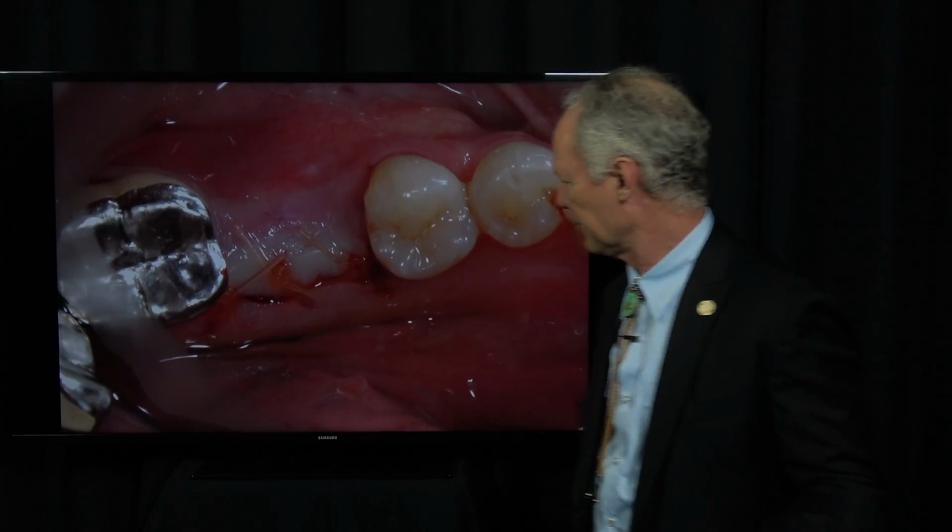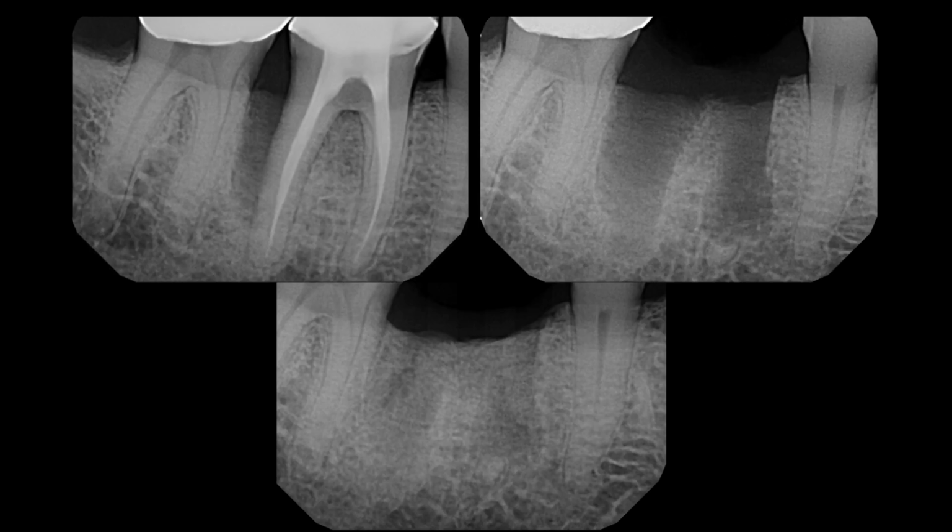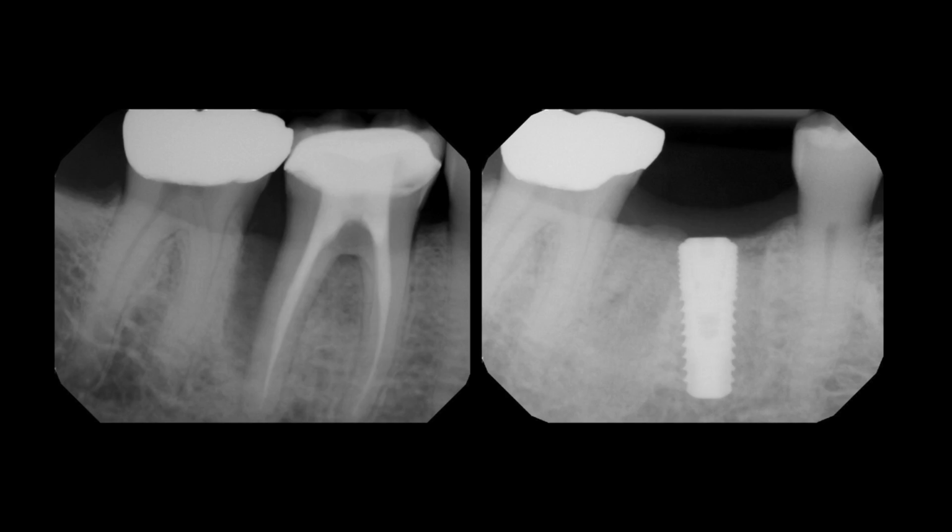All right, so extraction of a mandibular molar tooth, socket preservation with platelet-rich fibrin, and then implant placement 6 months later.